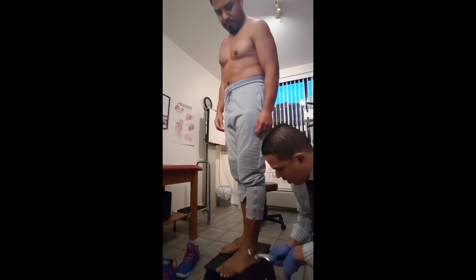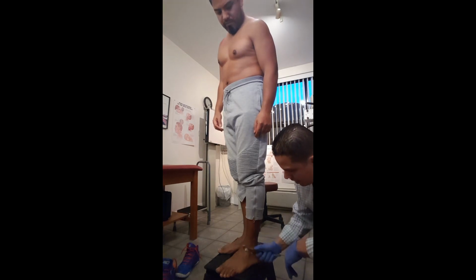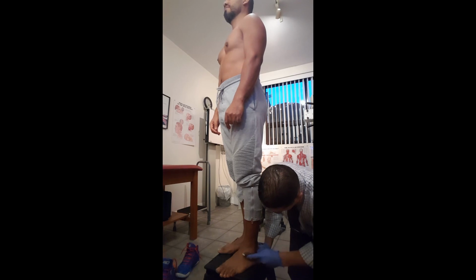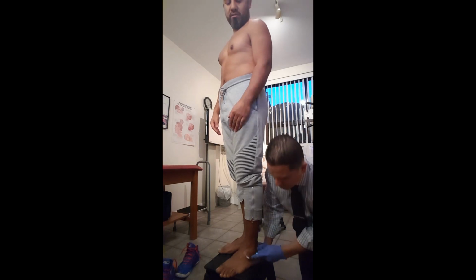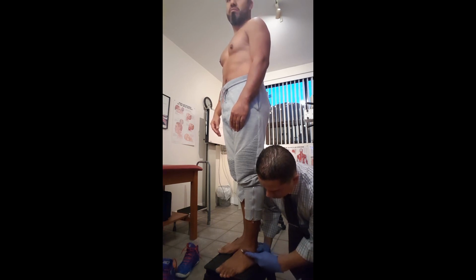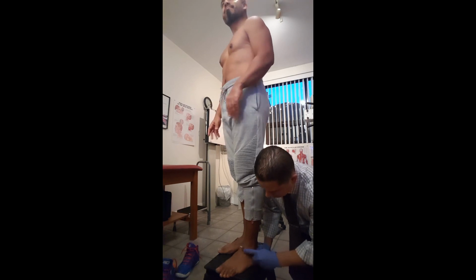All right, so now let's get to our work here. We're gonna work on the ligaments. And there was one particular ligament he was having a hard time with. Let's see how it behaves today. I mean, I feel the thing going. Yeah. If you feel the instrument coming through, I don't really care about that. That's not causing you pain. Now we're gonna go. I know it's this piece here.